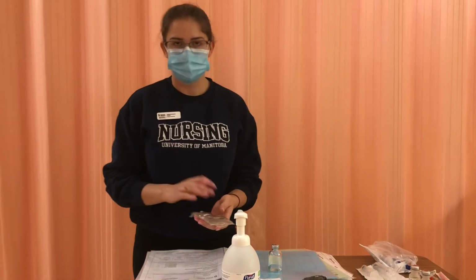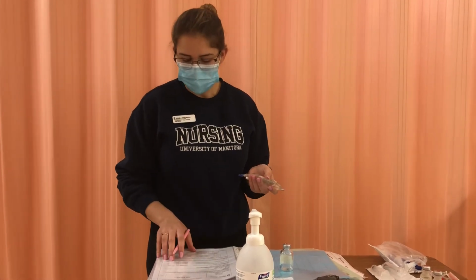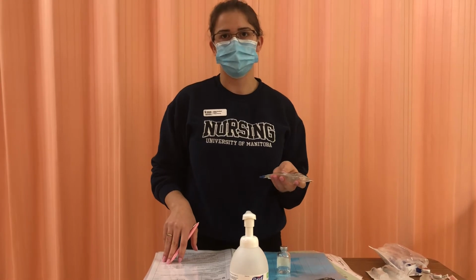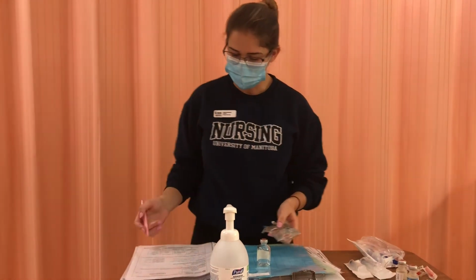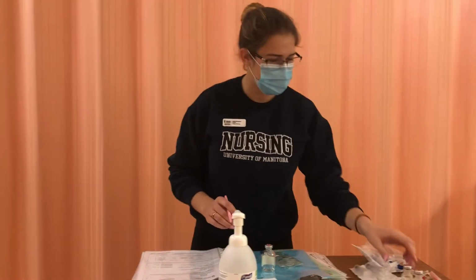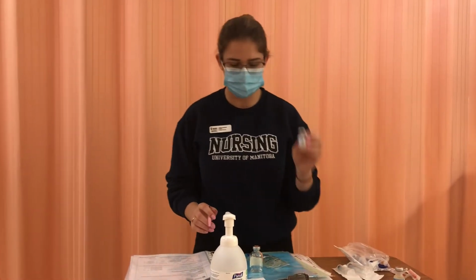I've selected the 50 mL bag because my patient has a fluid restriction. I'm checking the bag, making sure that it's not expired, and it's not, so it's good to go. I'm going to administer it over 60 minutes just because my patient has never had this drug before, and I want to be able to monitor their side effects to the drug. So I'm going to give it over more time so that I have more time to do that. This isn't expired, and I have my sterile water selected too, because that's what I'm reconstituting with, and this isn't expired either.